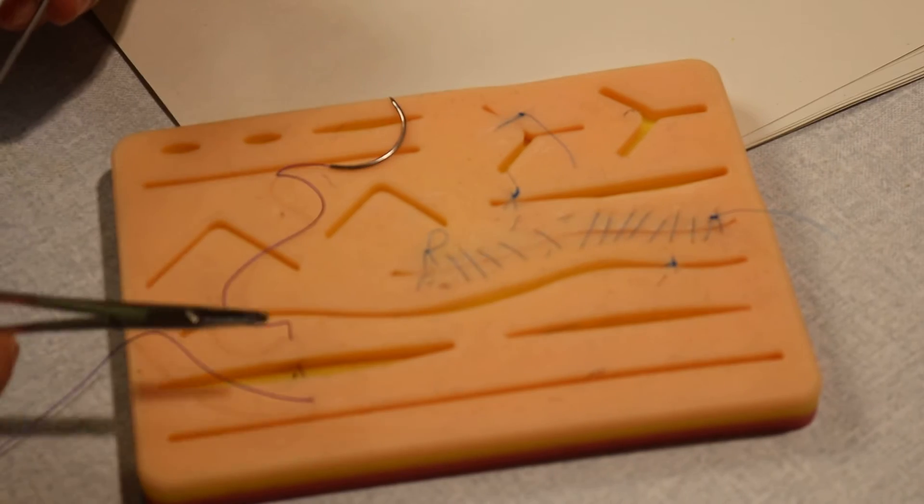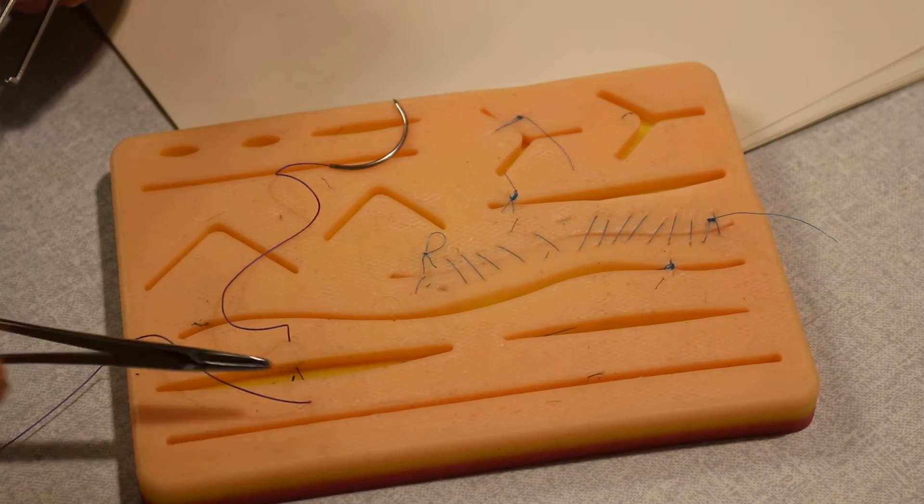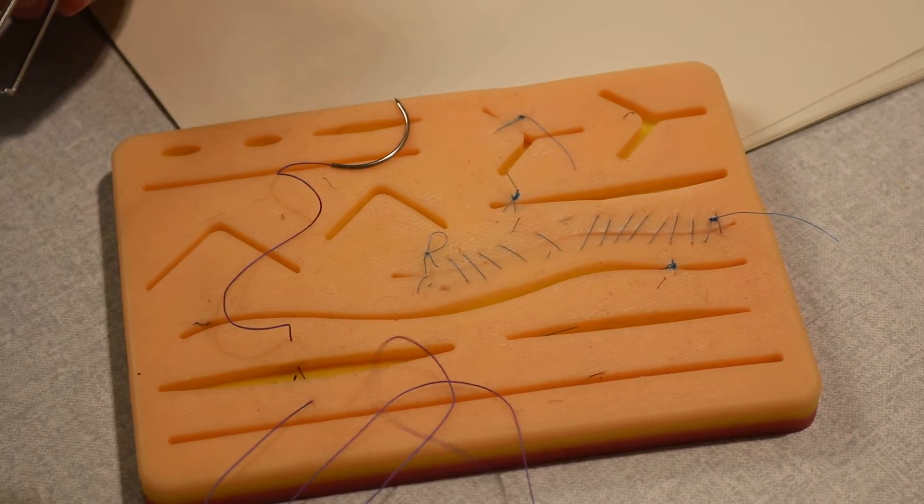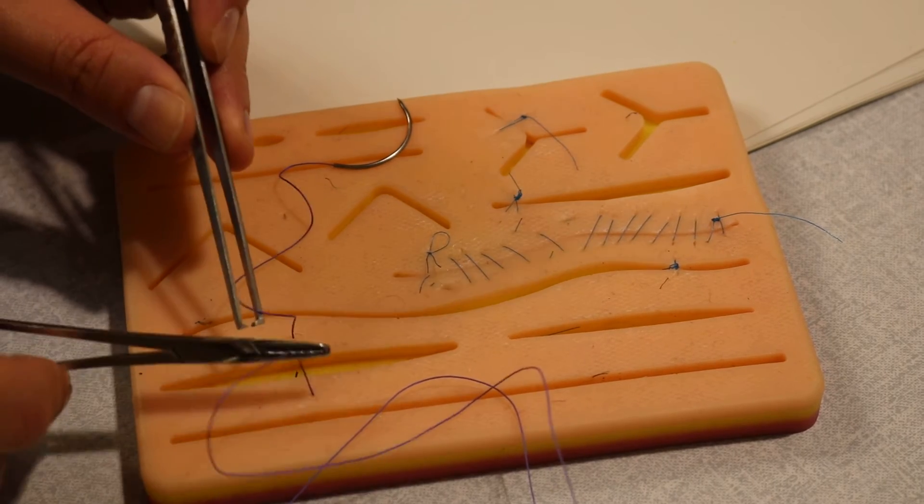So now we have a needle at one side and the rest of the thread on the other side. What we need to do is to tie this to this.